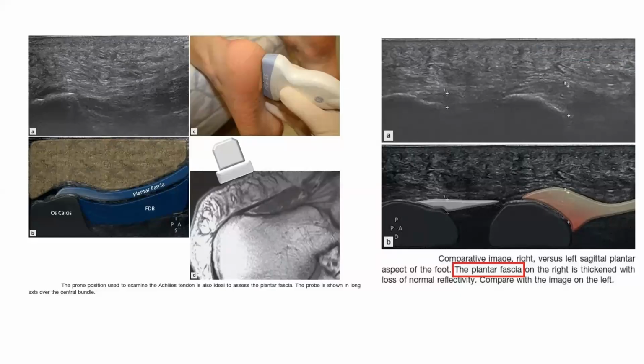So what are you all practicing in practice, which is cheap and available also? I use Tegaderm plastic, depending on the probe size, while doing intervention. Or I also use condoms, which are also cheap and best, because it is sterile, it is cheap, and it is readily available. But I don't use the fancy, expensive probe covers.